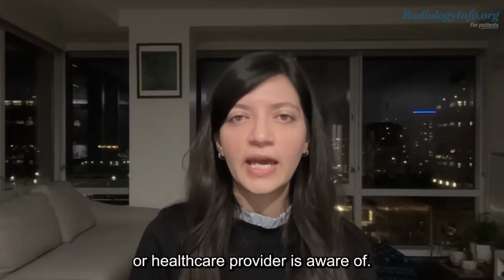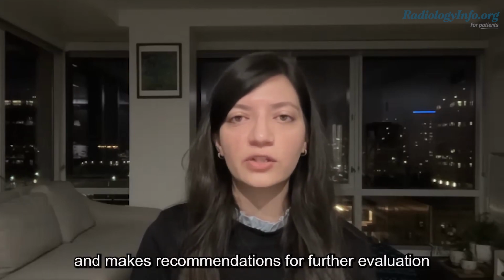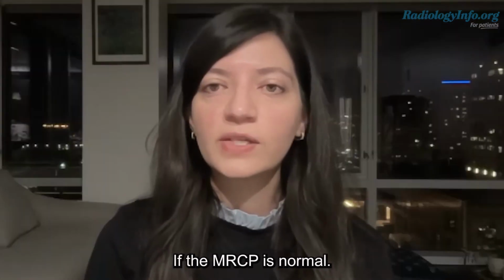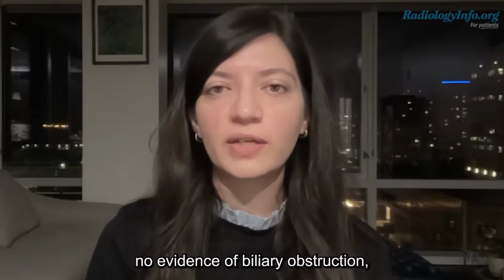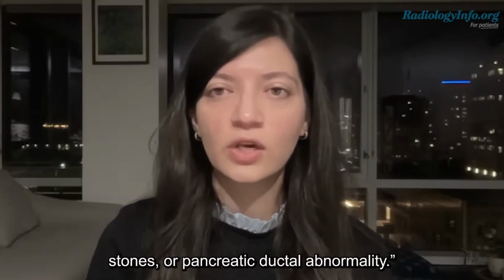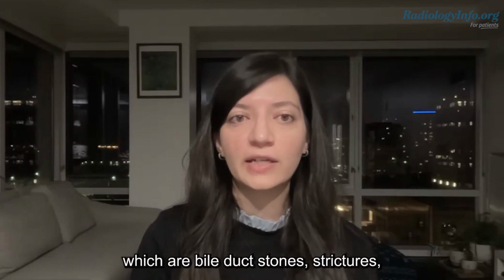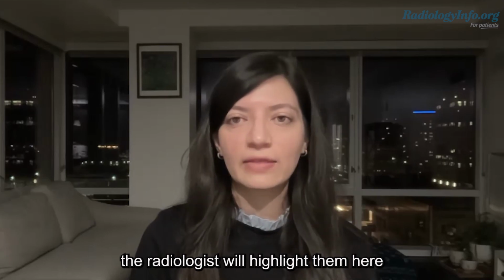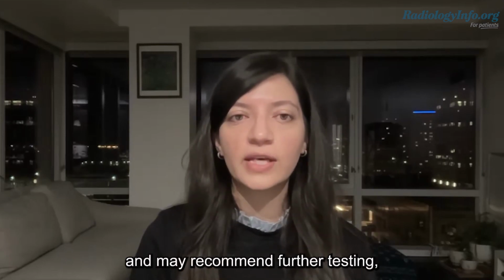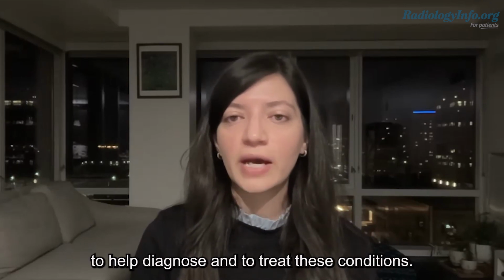Impression. The impression section summarizes the findings that the radiologist wants to make sure your doctor or healthcare provider is aware of. It lists the radiologist's conclusions and makes recommendations for further evaluation or additional testing. If the MRCP is normal, it may read: unremarkable MRCP, no evidence of biliary obstruction, stones, or pancreatic ductal abnormality.